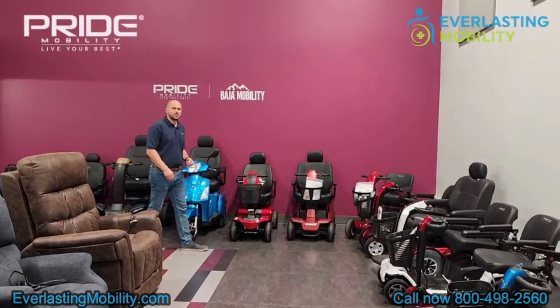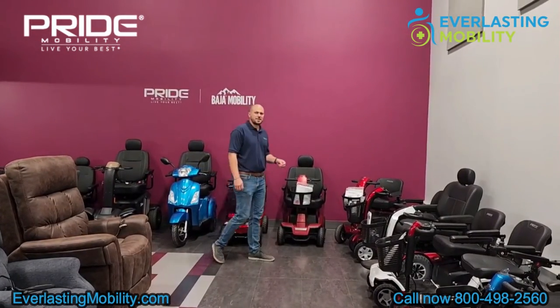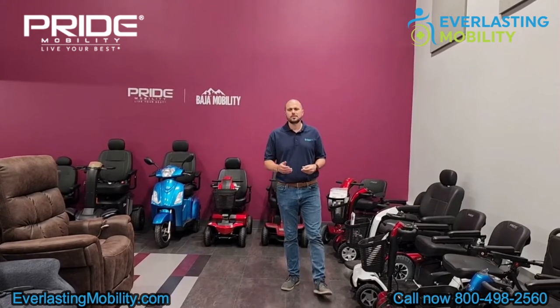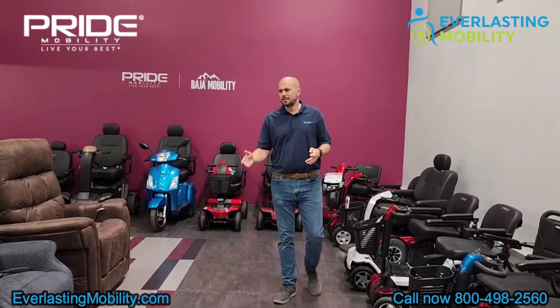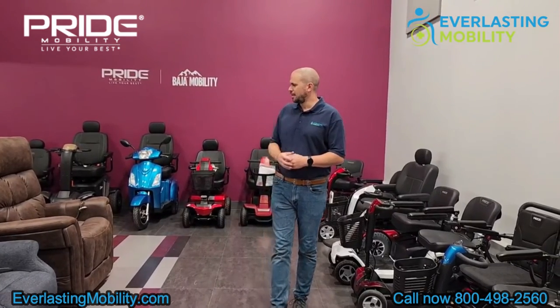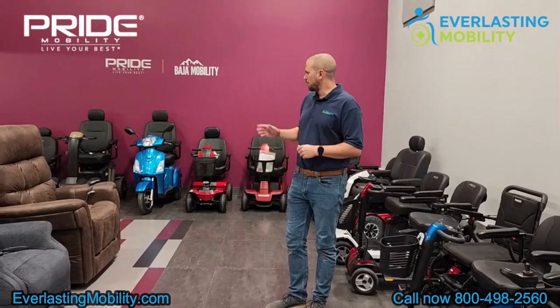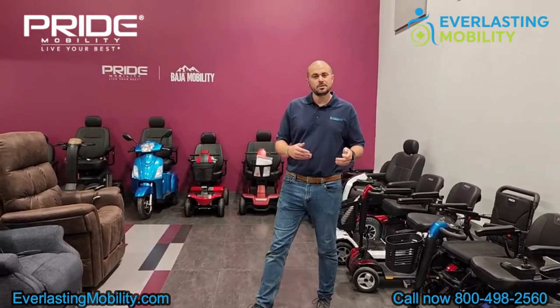Hi, this is Kel from EverlastingMobility.com. Today we're visiting Pride Mobility's corporate headquarters in Duryea, Pennsylvania. As you can see, they have a large selection of products: power wheelchairs, mobility scooters, and lift chairs. We're going to go over a few of them today, so let's get into it.